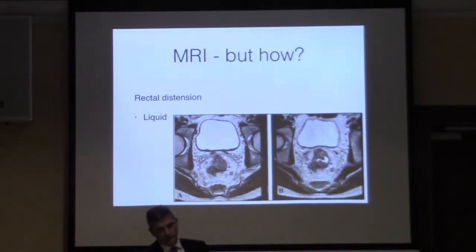Another example of liquid distension, and the same runs true here. So this is a tumour which actually was just quite stiff. We tried to distend the lumen with liquid, but it had a similar effect. It diminished the distance from the muscularis propria, or the outer aspect of the advancing tumour, to the mesorectal fascia. So it potentially put somebody that wasn't at risk to being at risk. So these are all quite good reasons why actually we should not distend.